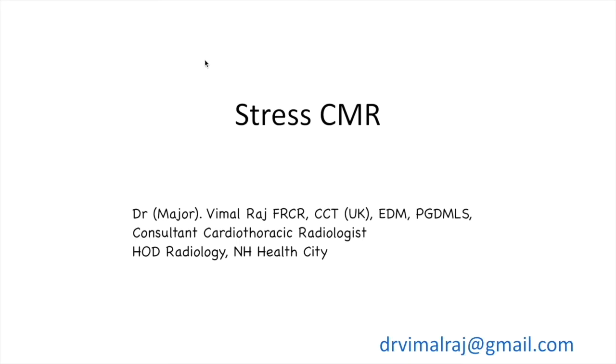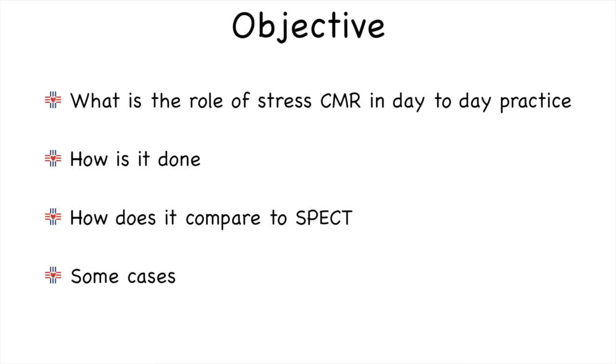Welcome to this session on stress cardiac MR. The objectives of the session are to establish the role of stress cardiac MR in day-to-day practice, explain how it is done and how it compares with SPECT perfusion imaging, and to show some cases.